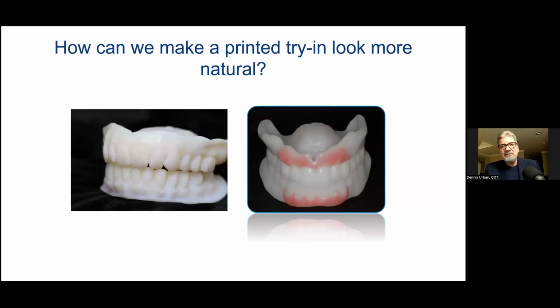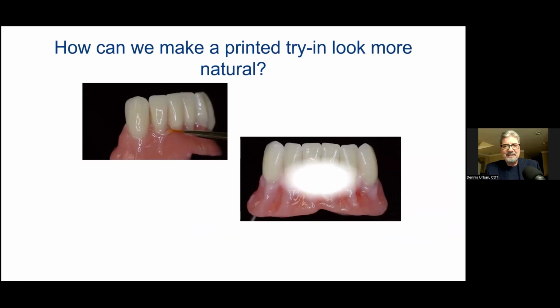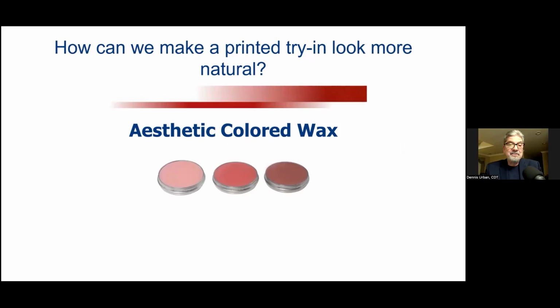But how can we make a printed try-in look more natural? Well, there are a couple of ways to do that. We can use denture-based stain, which is expensive and takes a long time to do. Or we can use aesthetic colored wax.